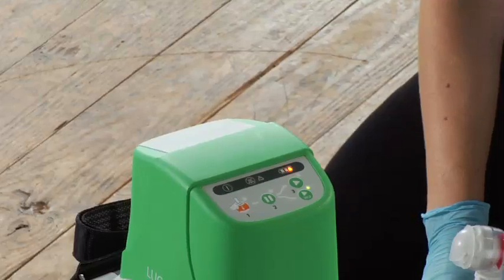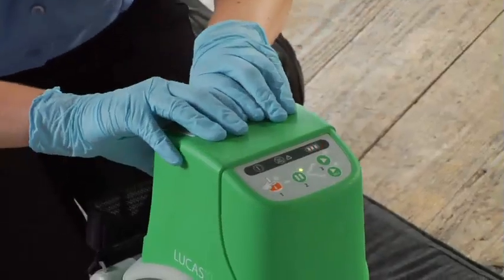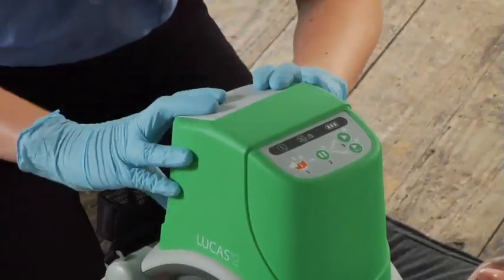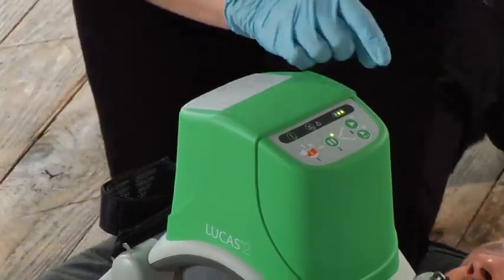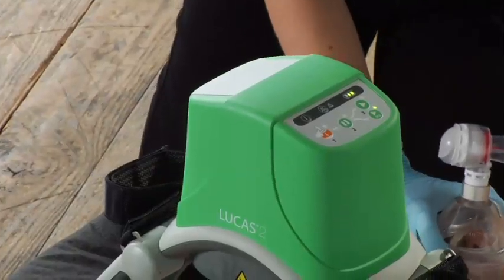If you need to change batteries while using Lucas, push pause, swap in a charged battery, and push active once you see the green LED. Lucas can remember its settings for up to 60 seconds during a battery change. If it takes longer than that, you'll have to readjust the suction cup before resuming compressions. The same applies if you switch to external power. Remember, you always have to have a battery in Lucas even if it is plugged in — it won't run without a battery.